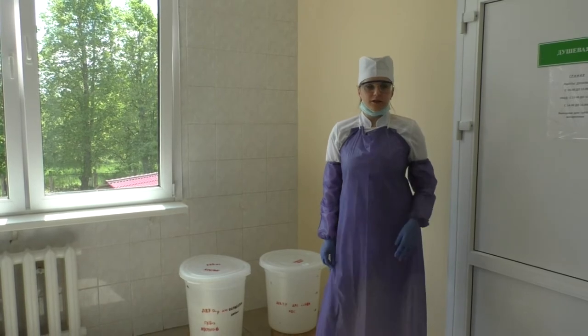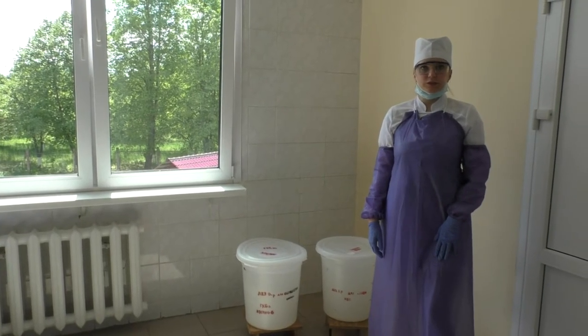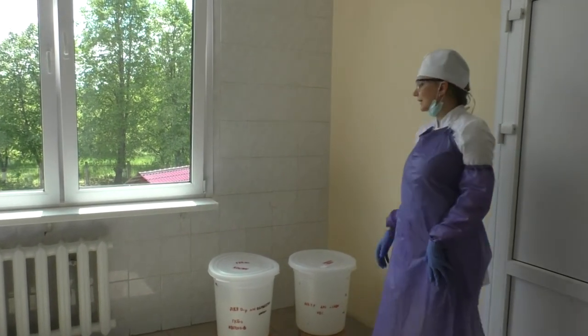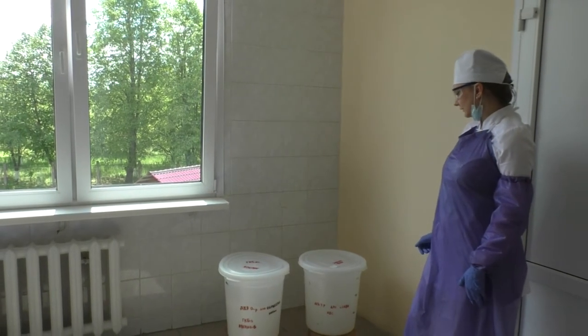You should prepare all disinfectant solutions before the procedure.